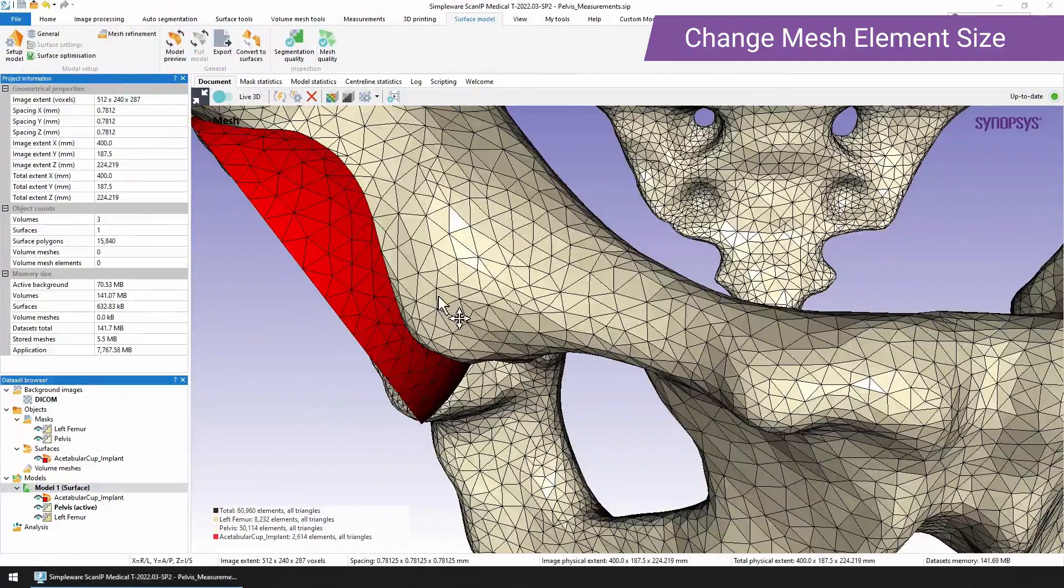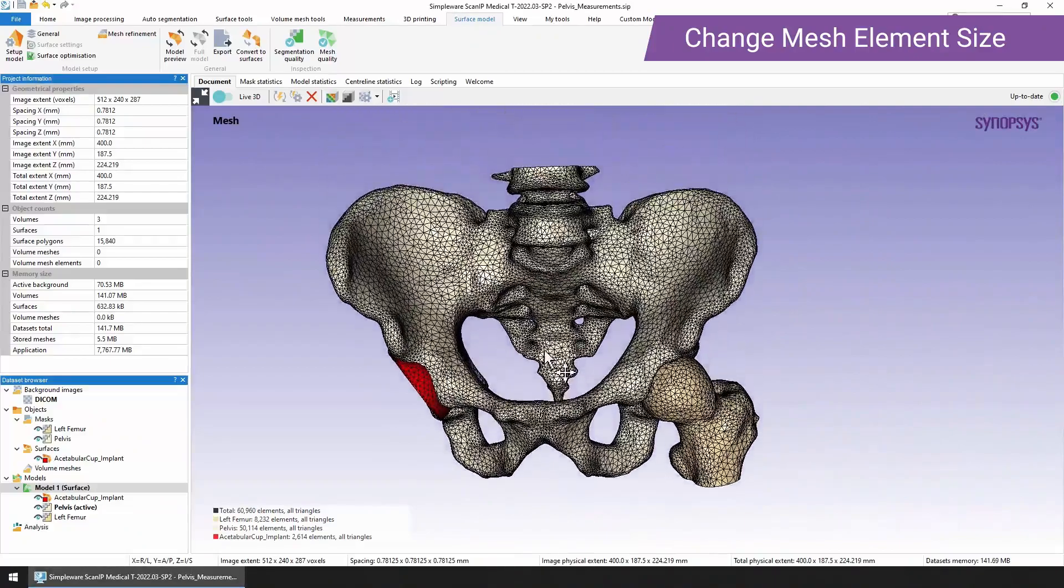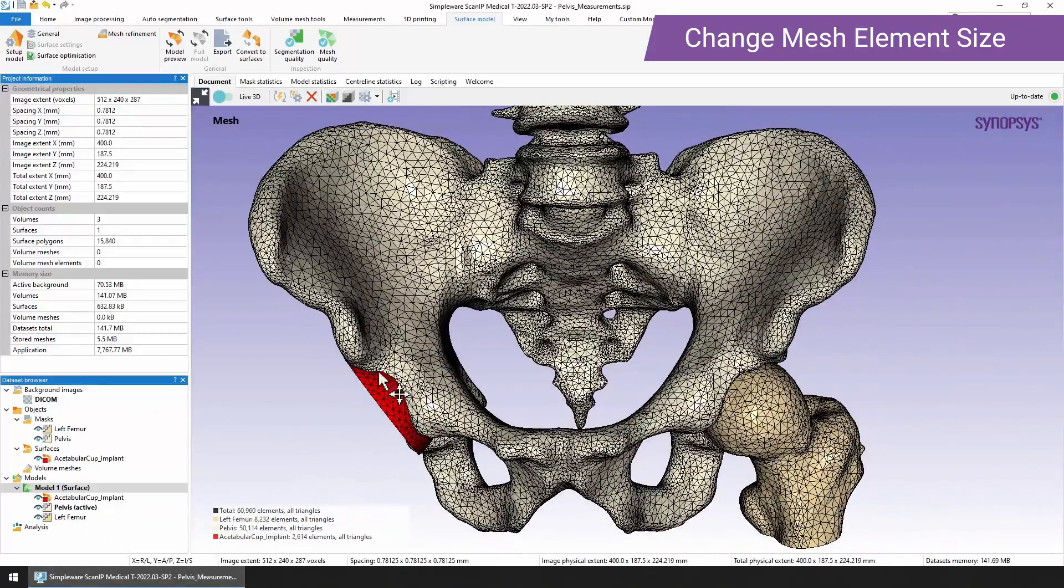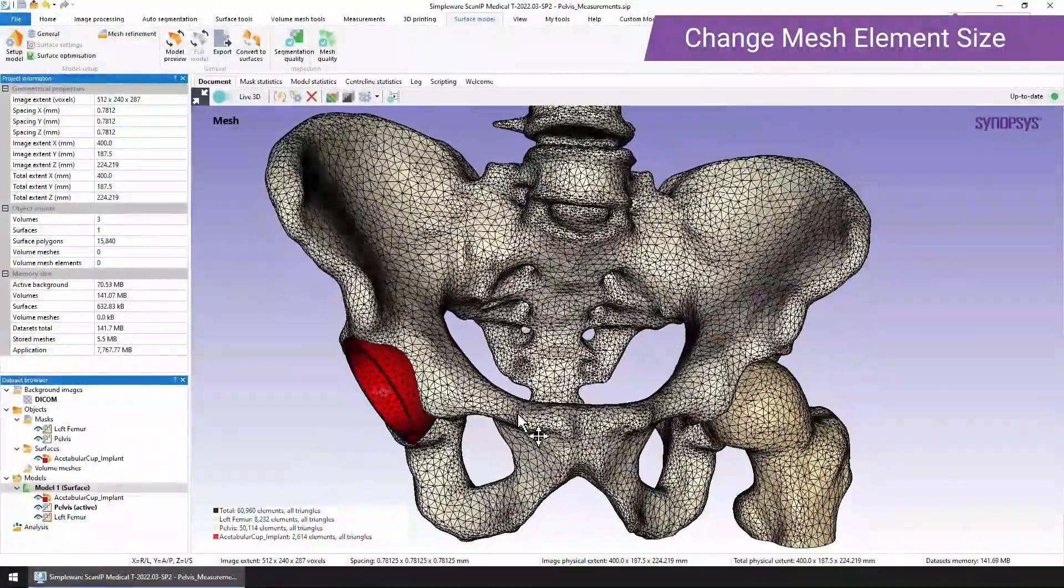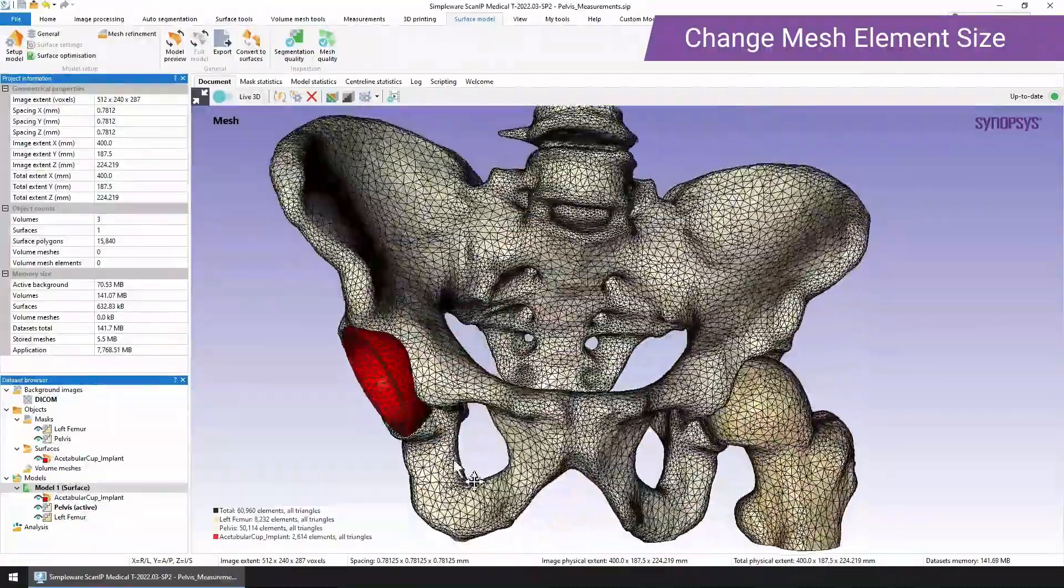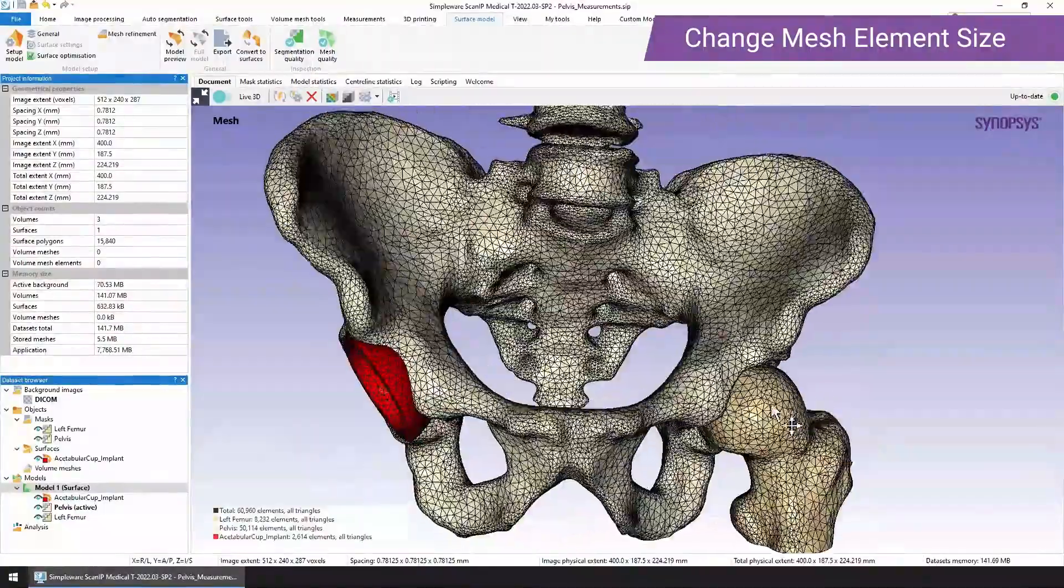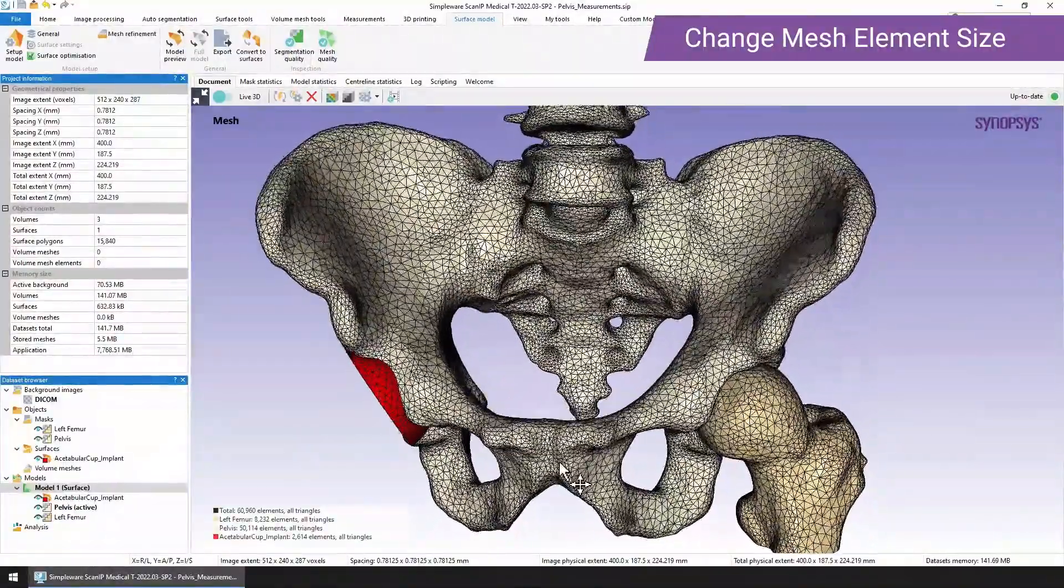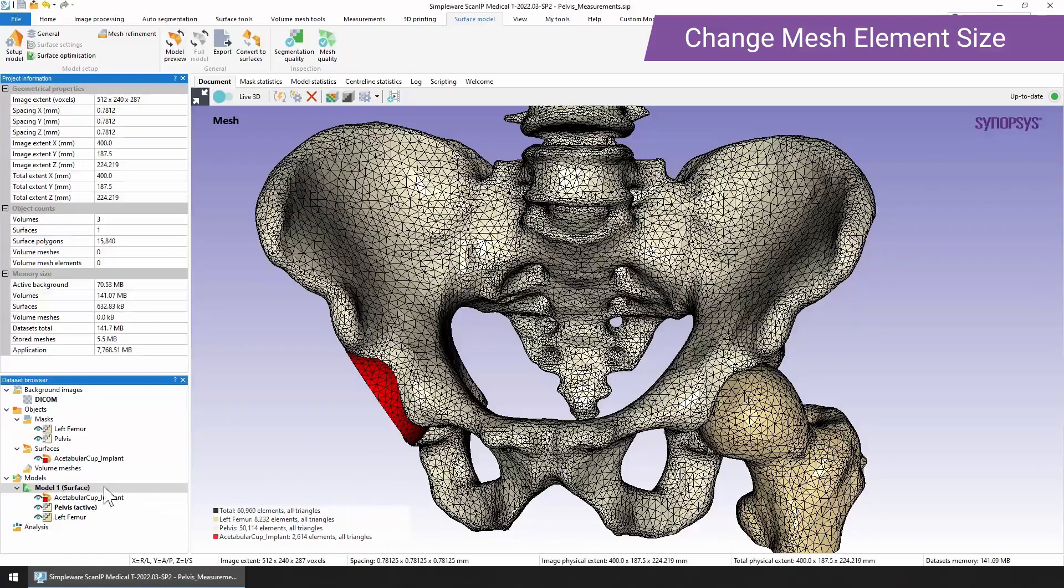Here you can see the output of that mesh. Now you can see that we've got much less elements. Instead of 900,000 elements we've got a total of just under 61,000 elements. You can see that we've sacrificed some of the accuracy in the topology but not a lot, and we've got a much smaller model which would be much easier to work with. This is always something that you need to weigh up on: How much accuracy do you need? What are you going to do with the model going forward? What's appropriate? So there are lots of different options there that you can explore for surface models.